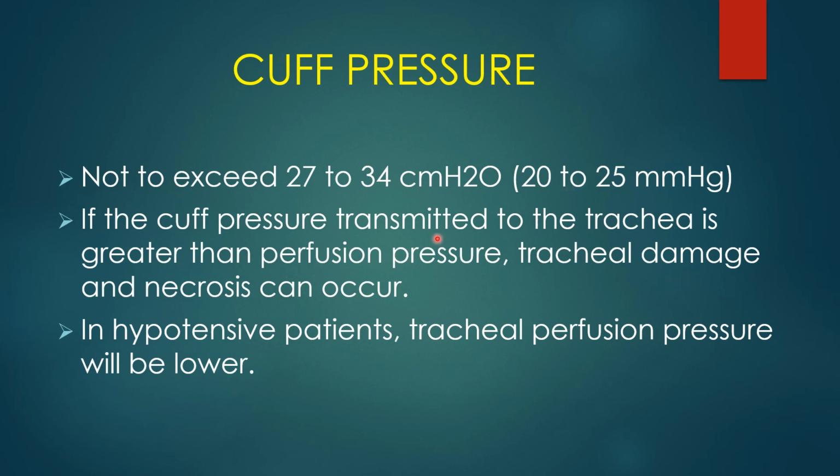Now, that's normal pressure in the tracheal capillary bed. But what if the patient's hypotensive? Well, then that pressure will be even lower. So what we want to do is use the cuff pressure that is maintaining a seal, but not too high, and we don't want it too low.